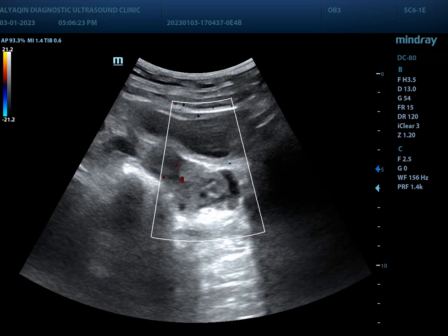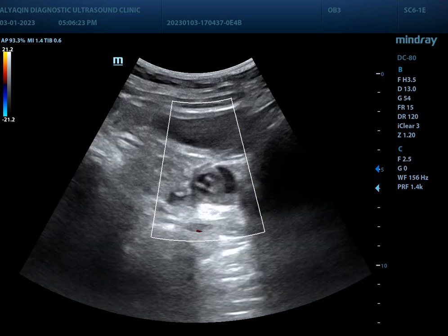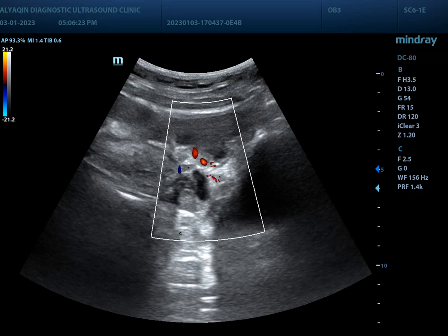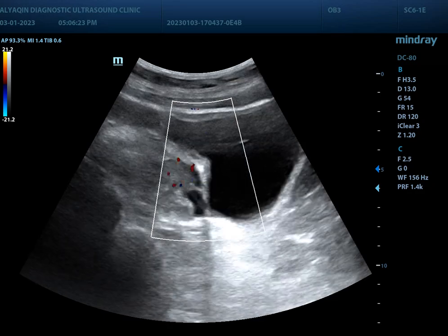Here is the left ovary — normal texture, with multiple follicles.